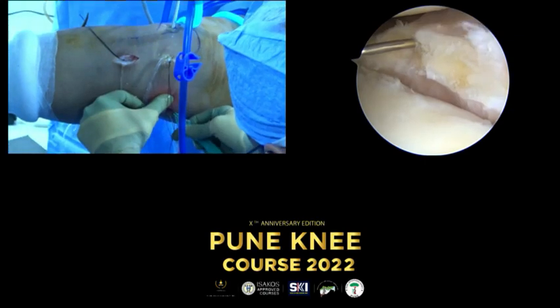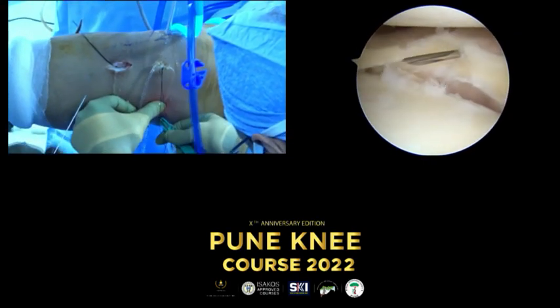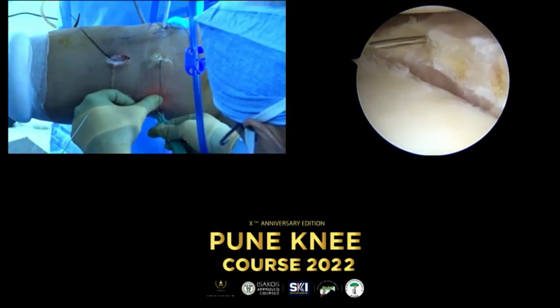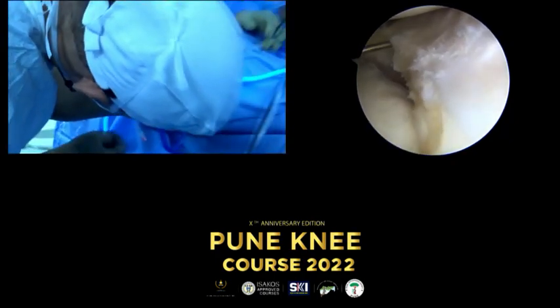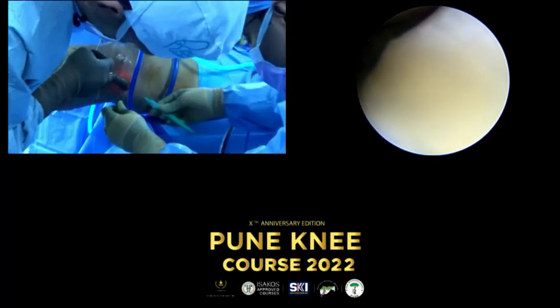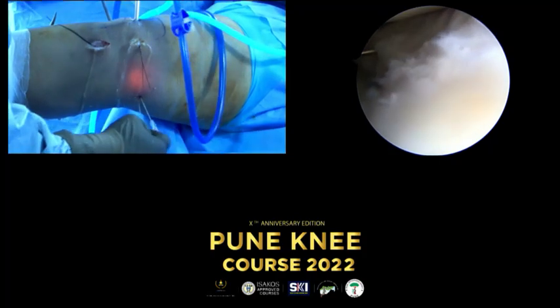So I think this is a good trick which Pablo is showing us. If you want to pass in needles from outside in, then you should switch off the lights in your operating theater. Look at the transillumination that he's looking at right now, and that takes you exactly to where you should be putting your needles. So that's a very good trick that you should try and use in your clinical practice.